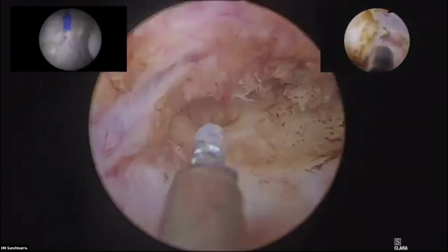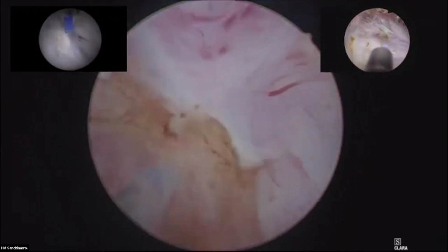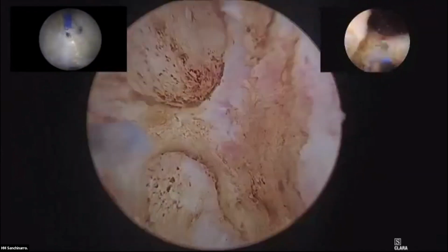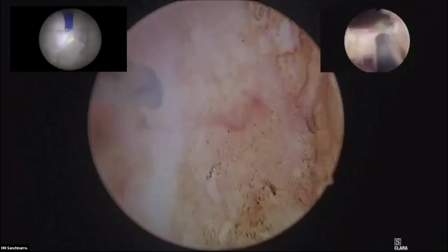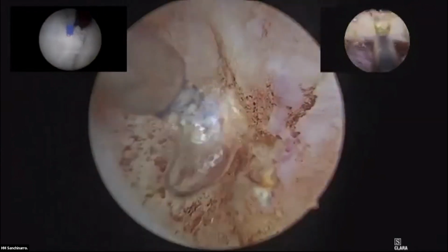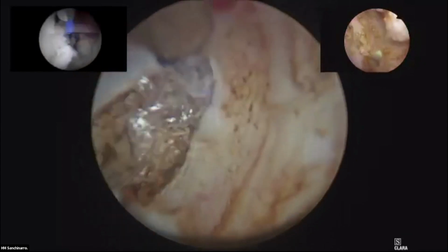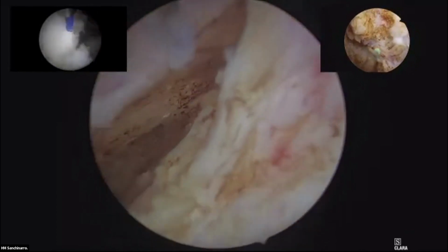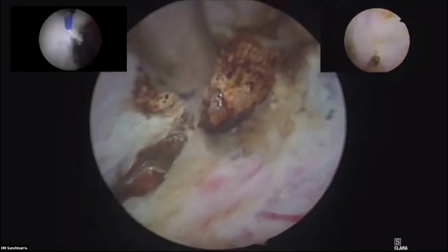Do you think you have to have some experience with enucleation with holmium before starting with thulium, or not? Because actually, I've done the opposite pathway. I did all my training with thulium, and now I'm also doing holmium enucleation with the same technique. So I can tell you that, as I told before, enucleation is enucleation.